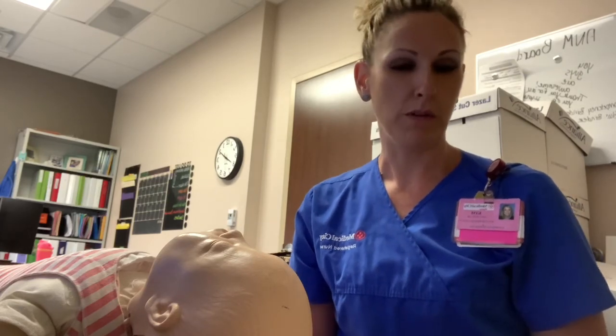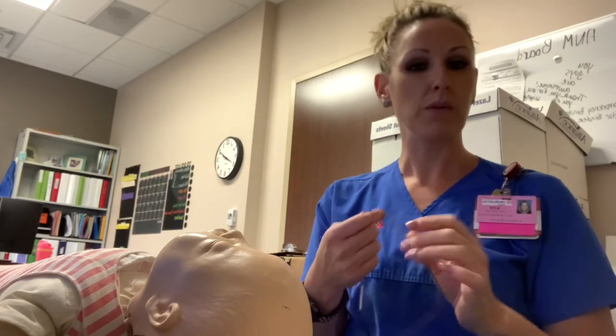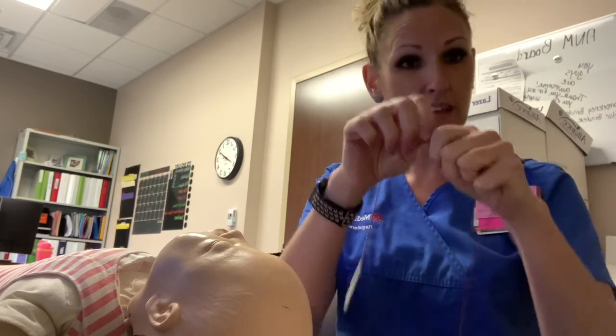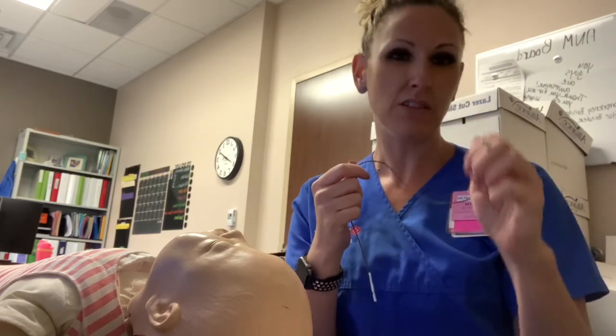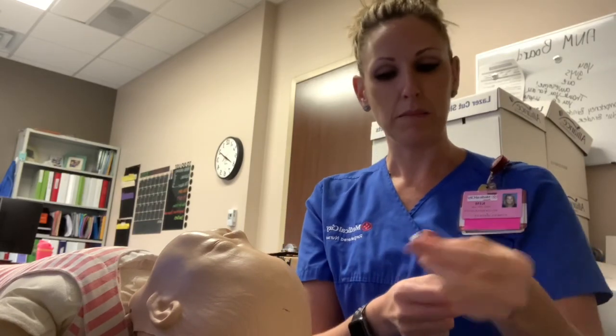When you do the removal, you can do it while the baby is still inside. You would just do a vag exam, same thing, and with your two fingers, twist counterclockwise. You don't ever want to turn or separate these and pull. That twists it kind of a little hard and can damage the baby's head. So it's always going to be a counterclockwise for removal.